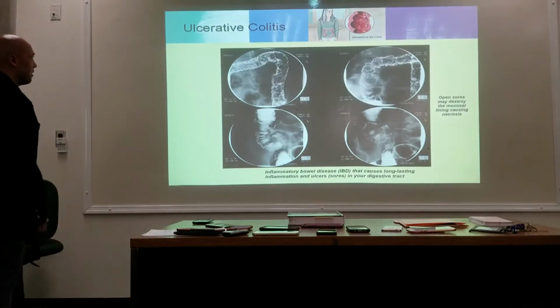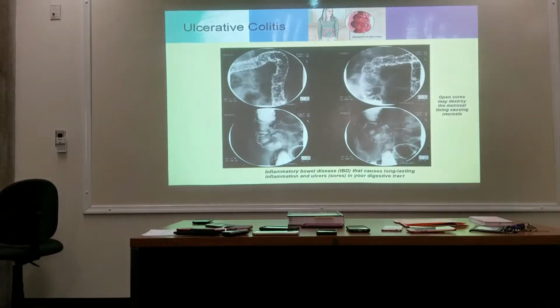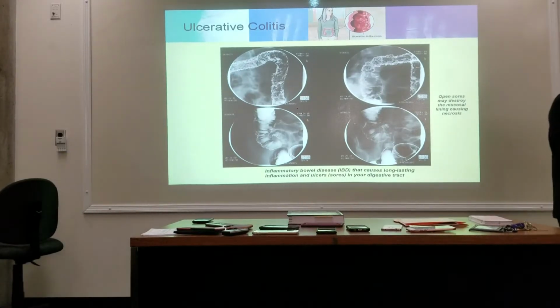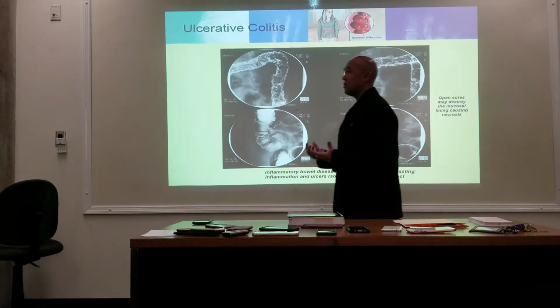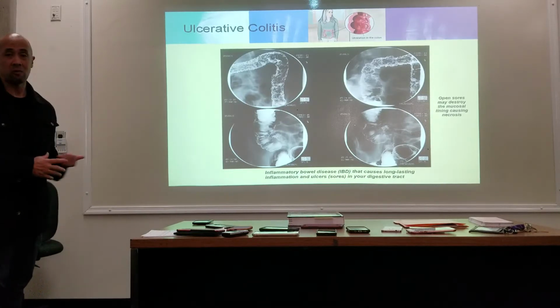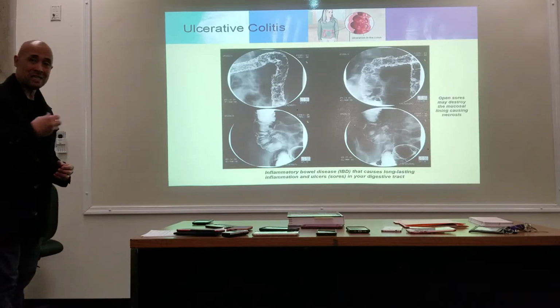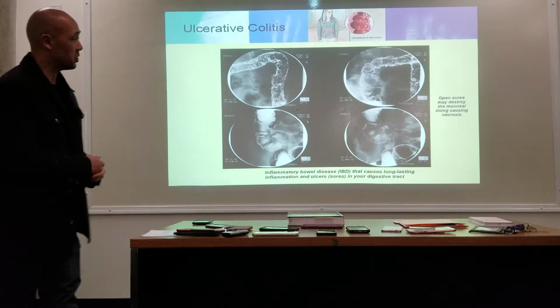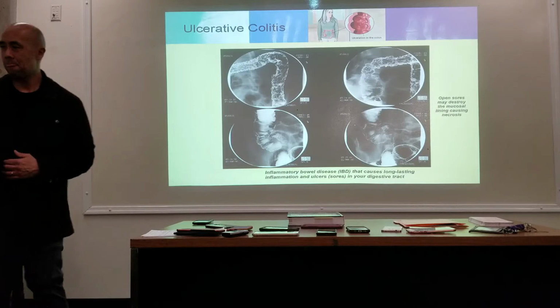Here are some images of ulcerative colitis. Now, if the patient is suspected with ulcerative colitis, again, ulcerative means that there is a breakdown in the lining. So if there's a breakdown in the lining, that would be a contraindication to using barium, and they should be using gastrografin. Okay? Because the barium is going to seep into the ulcer and again cause complications.